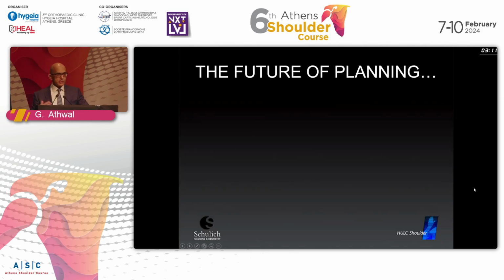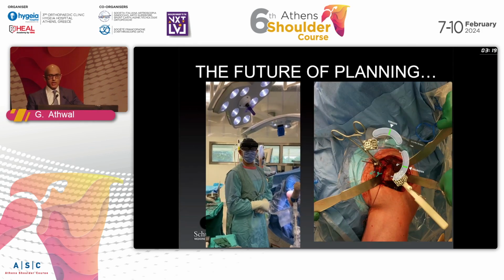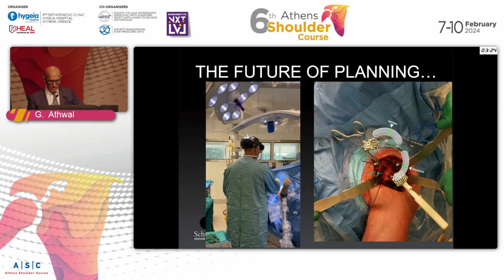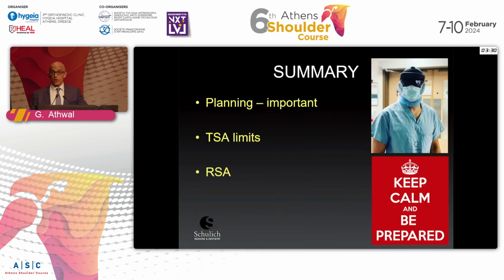All right, so what is the future of planning? As I mentioned, I think the future of planning is definitely going to be robotics, mixed reality navigation, optical navigation. So this is a case that I just did recently where we used mixed reality navigation to determine where our implant positioning is, and you can go ahead and put in your guide pin and hopefully have some degree of accuracy and precision.